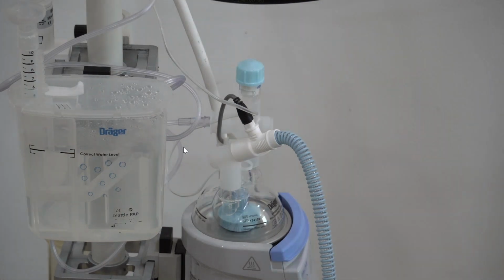With regards to the oscillation, I think I've mentioned this already, and what we're going to do is include a slide with a link to the article. Basically, this oscillation generates volume, and this volume is obviously the volume that is being delivered to the patient.